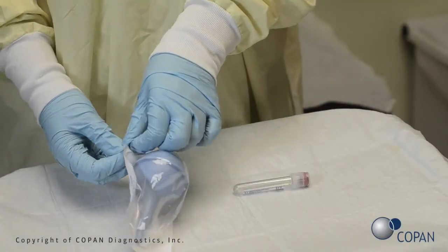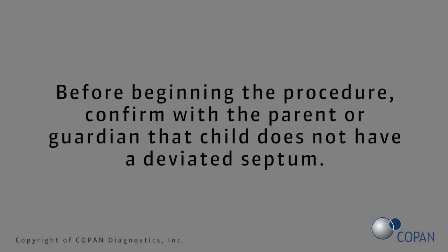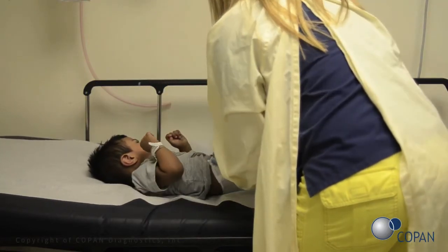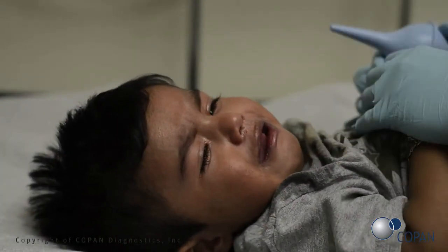Open the sterile bulb package. Before beginning the procedure, confirm with the parent or guardian that the child does not have a deviated septum. Lie the child down or have the parent or guardian hold the child so that their head is tilted back and neck is extended to allow for the pooling of the aspirate in the nasopharynx.